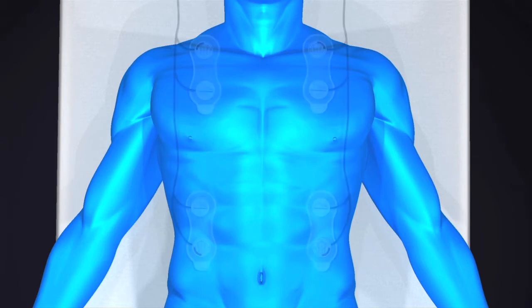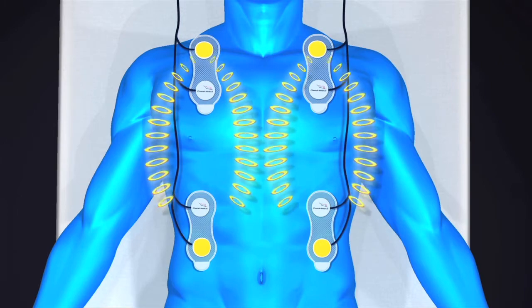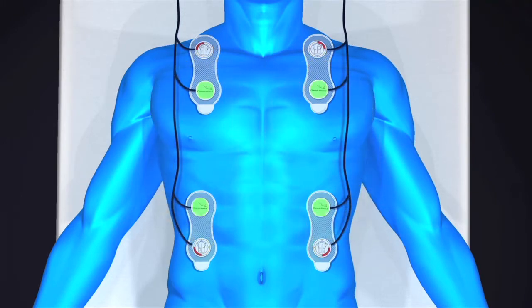The basis behind the Starling SV is the use of time delay or phase shifts, which occur when an alternating electrical current is passed through the thorax. The Starling SV has eight sensors on four sensor pads. Four outer sensors emit a low-level electrical current and four inner sensors detect the information and send it back to the monitor.